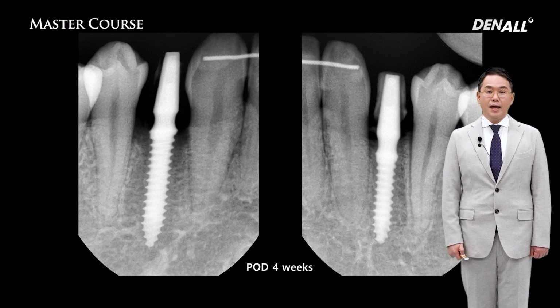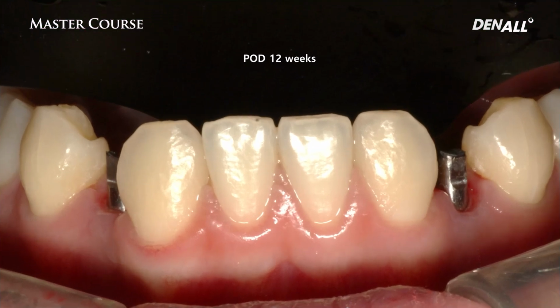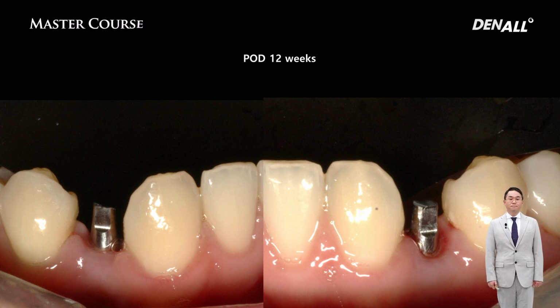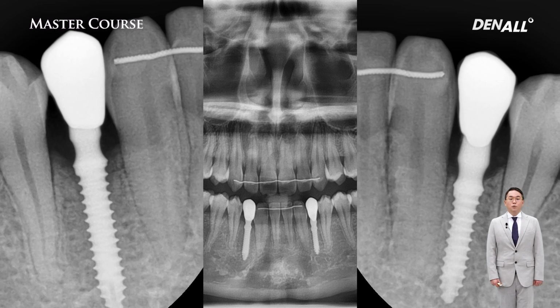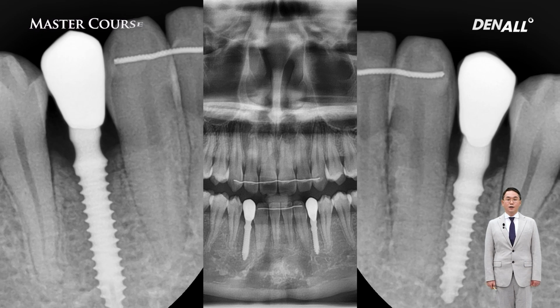Post-op 4-week healing and PA. Post-op 12 weeks, before taking the final impression, and there's no gingival recession or papilla loss at all. Osseointegration of the implant was successful. Post-op 12 weeks, before the delivery of the fabricated final prosthesis. After the delivery of the final prosthesis, panorama, PA. As you can see, the buccolingual and mesiodistal bone width was very limited, but the implant is placed with ideal angulation and position without damaging the root of adjacent teeth, which led to the ideal fabrication of the prosthesis.